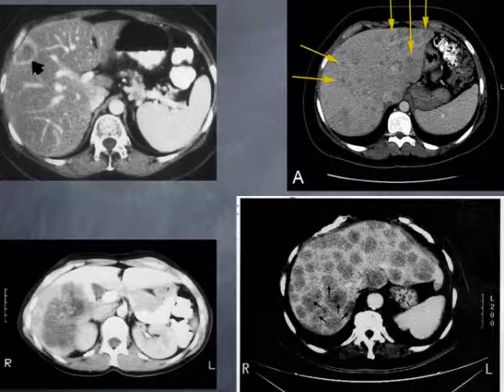And if your liver is the one on the bottom left, well, that one's potentially a problem because that is a very large tumor. It's occupying potentially more than 50 to 70% of the liver.